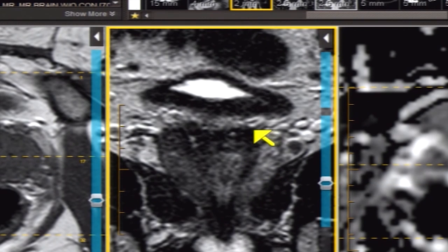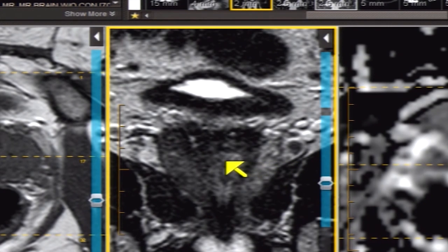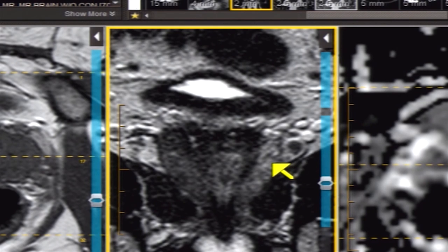We can also divide the gland into a base, apex, and central third. That central third can be divided into the outer half — the lateral segment — and the medial half — the intermediate segment — each with a left and right side. This gives rise to abbreviations like 'left mid lateral PZ' for a specific location. That's coming shortly.